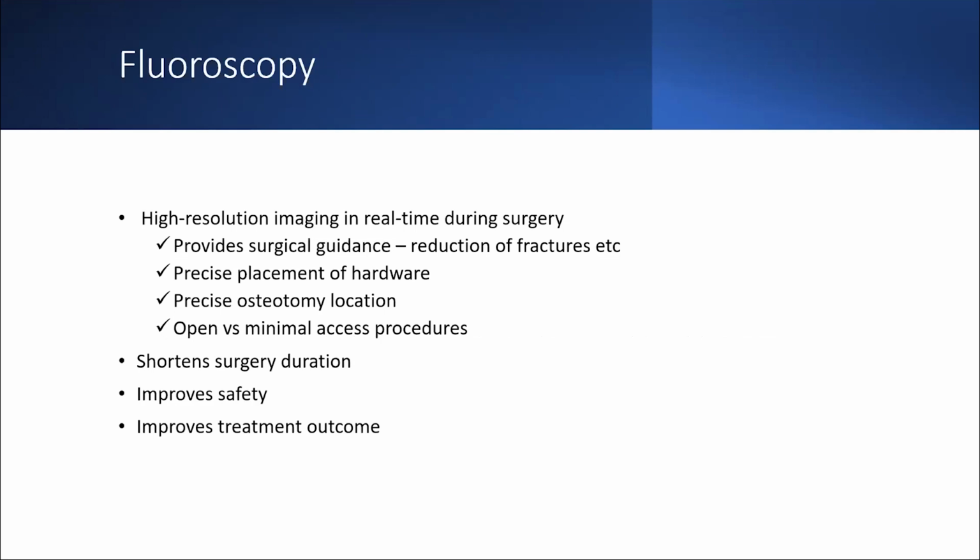So fluoroscopy essentially allows high resolution imaging in real time during surgery, and the advantage of this is it allows precision. You're able to locate the site of your osteotomy, place implants in the exact location where you want them, and achieve reduction of fragments or fractures appropriately.